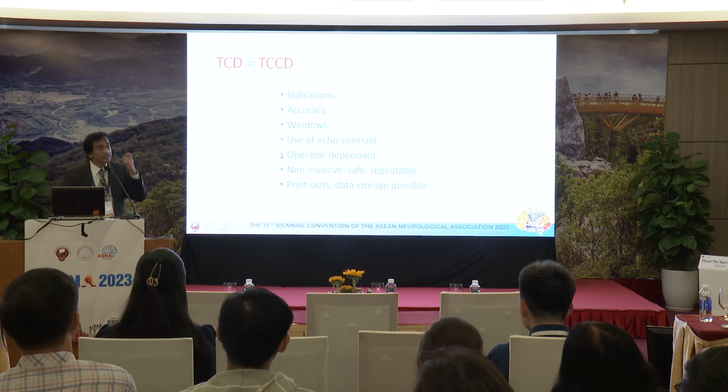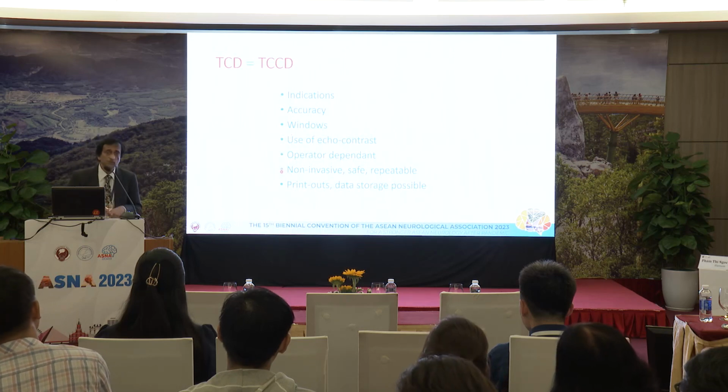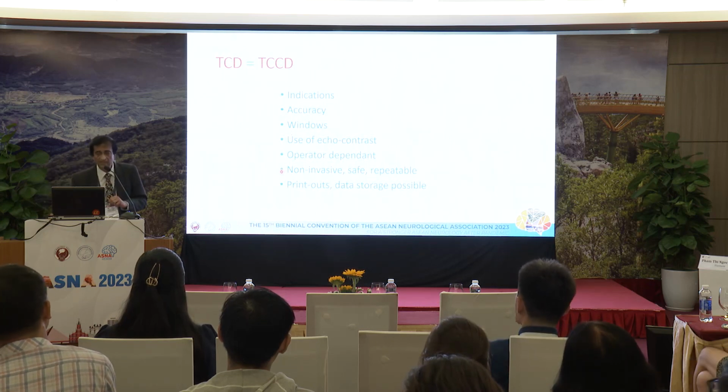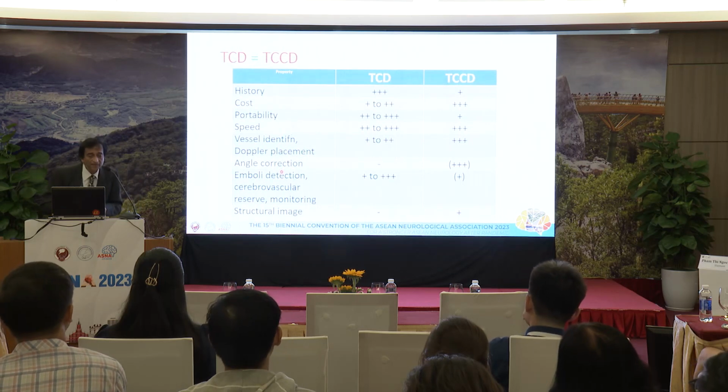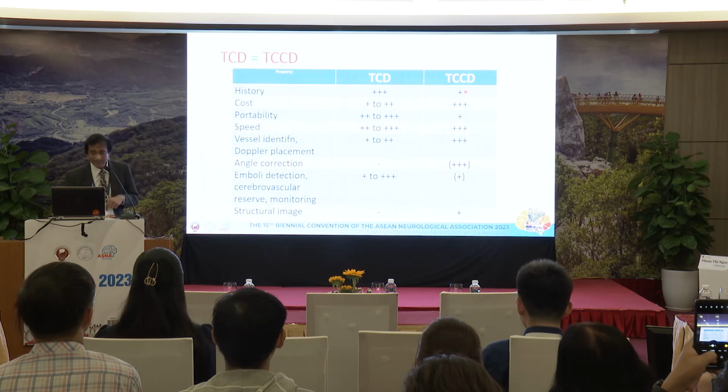You still need skill, but still it is safe, non-invasive. Do it as often as you like, and you always can print out the data, store it. It's very, very similar to TCD. But there are some differences. TCCD is a newer technique.